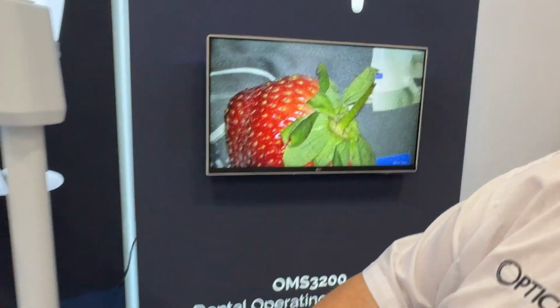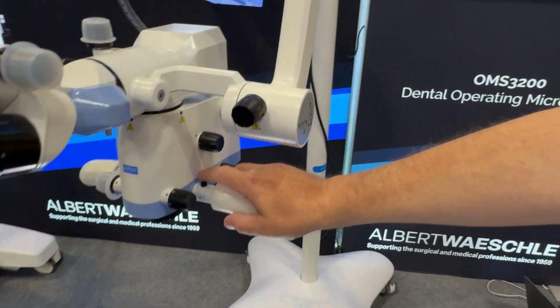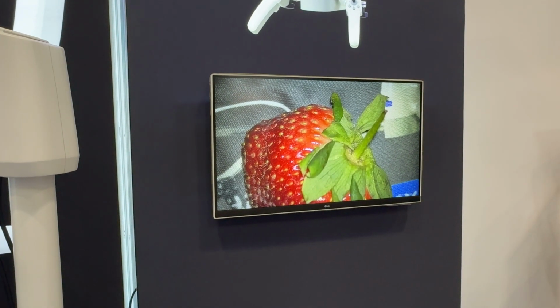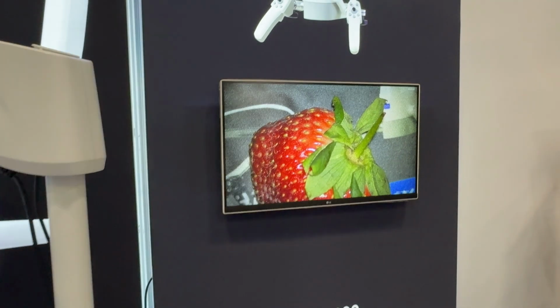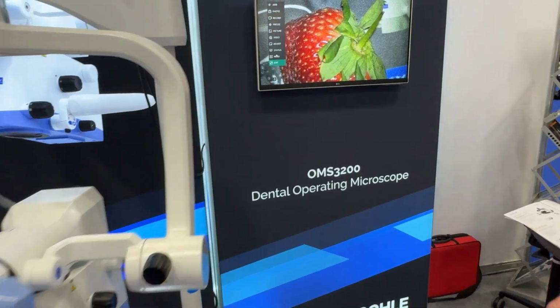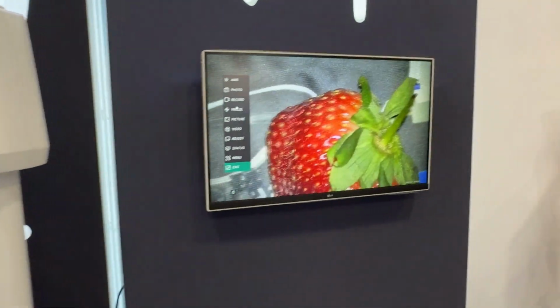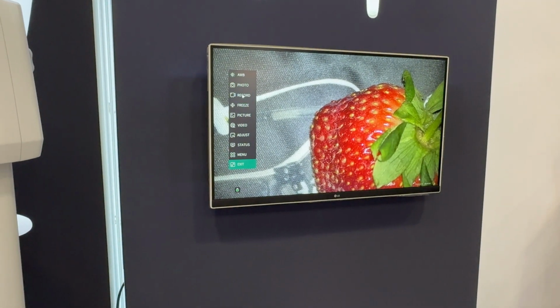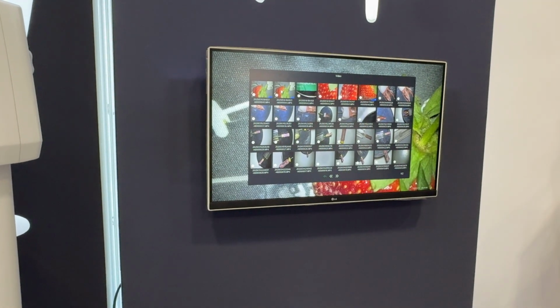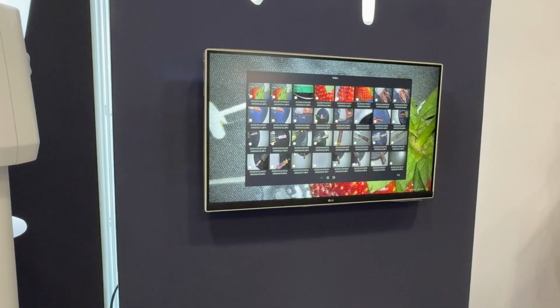And if I then press either on the mouse or on the handle to take a photo, it's then taking a photo. Brilliant. And then I can stop my recording. And if you then wanted to access them on the screen, you can just go in, find your recordings in there, go onto the video one, and these are all the videos that you've taken.